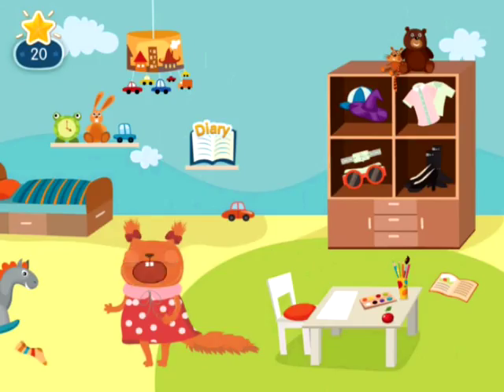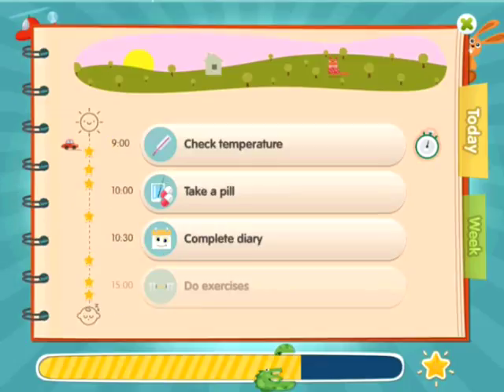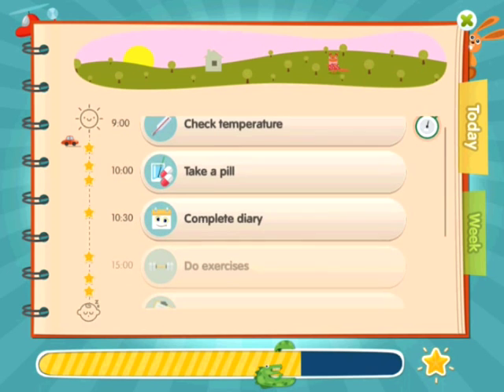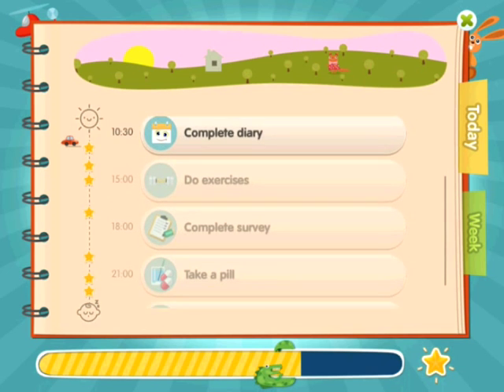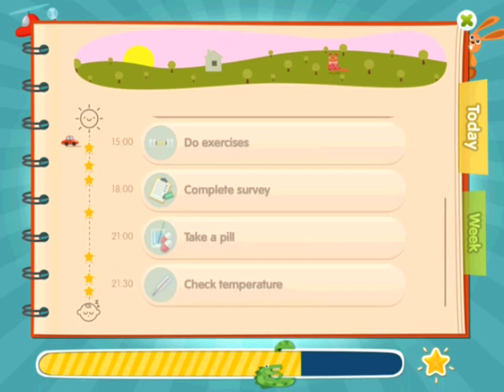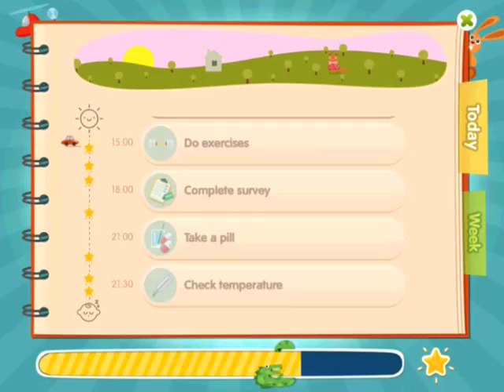A full clinical protocol — everything that a child needs to do — is recorded there in the diary. All of the activities are presented as buttons that become active whenever it is time to perform the required activity.